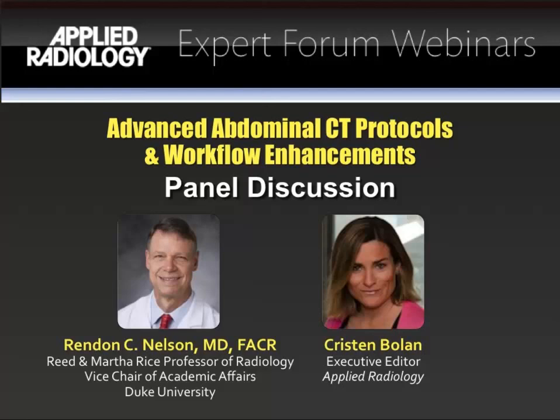In what situation do you prefer to use barium as oral contrast? I don't really care that much from a diagnostic standpoint or from an efficacy standpoint, but the patients tend to prefer the dilute barium preparations over the dilute Gastrografin because it tastes a little bit better. It's a little bit more palatable. But in general, it doesn't really matter to me. If you have a patient that's allergic to iodine, philosophically, it's better to give dilute barium, although most patients that are allergic to iodine get so little absorption of the intraluminal iodine in Gastrografin, because it's so dilute, that they won't have an allergic reaction from that. But in general, we have a pretty low threshold to use dilute barium.